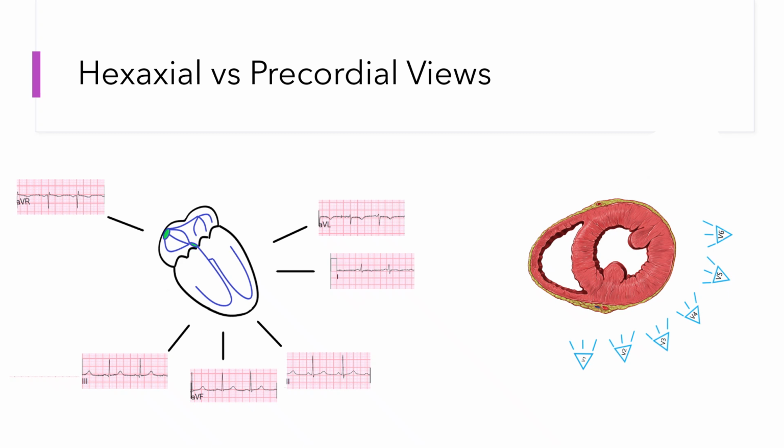It also is worth your time invested, because when we start talking about other ECG changes as you grow and develop your ECG identification skills, this is paramount and is the foundation to all of that, whether we're trying to identify right ventricular strain patterns or LVH or left bundles, and on and on, all those subtle ECG patterns. Hypertrophic obstructive cardiomyopathy is another one. It'll make a whole lot more sense if you commit this to memory.